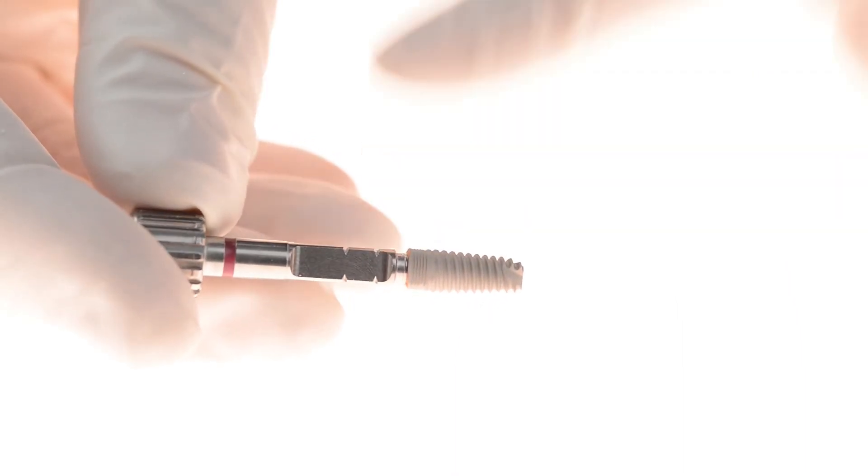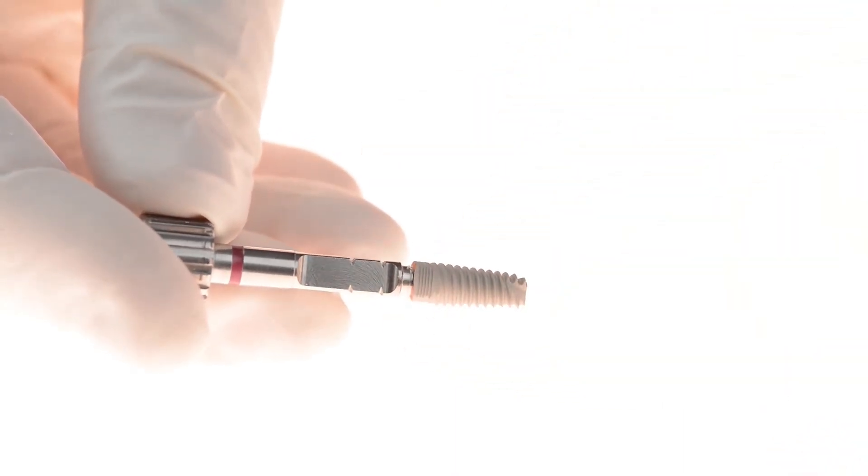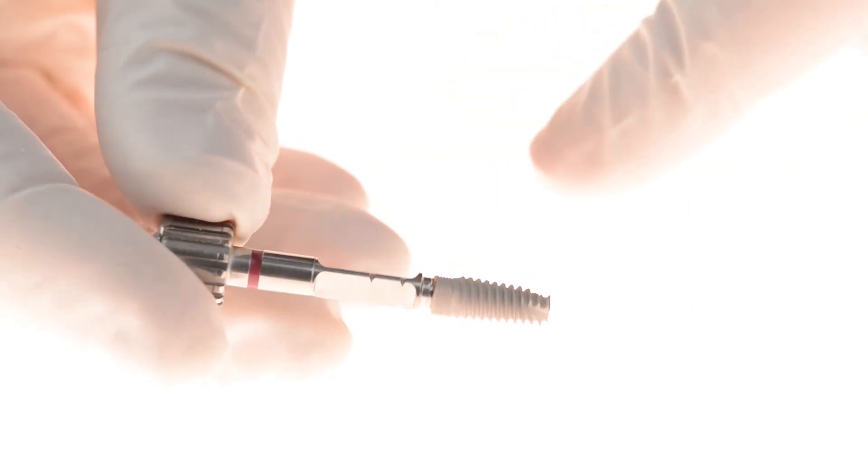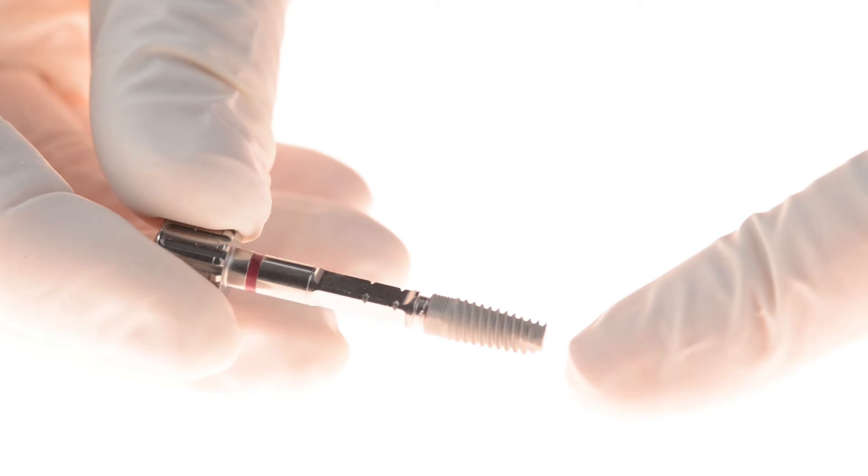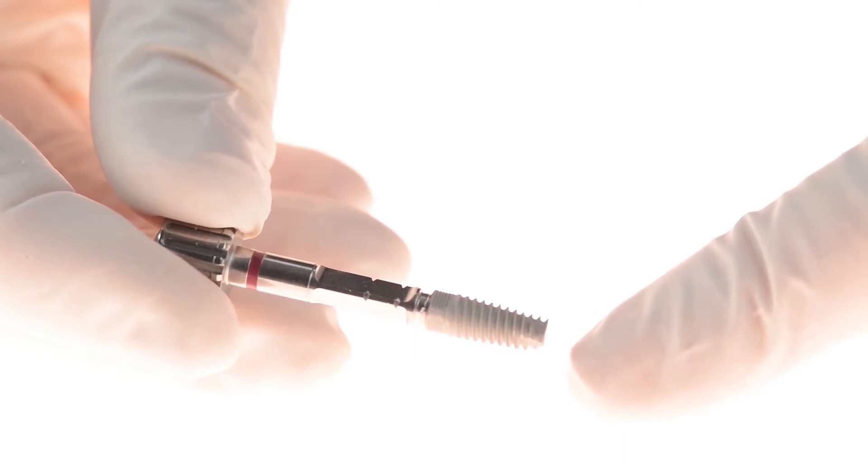It is now possible to line up the flat walls of the implant correctly for maximum bone growth. The flat apex is designed to allow good grip into bone, especially in immediate placement procedures.